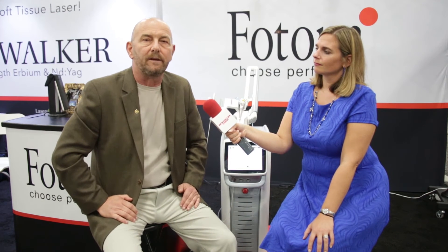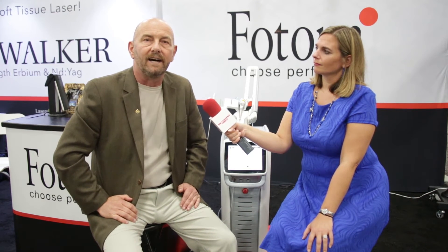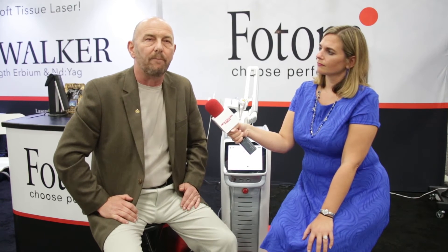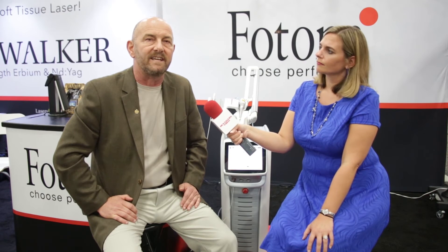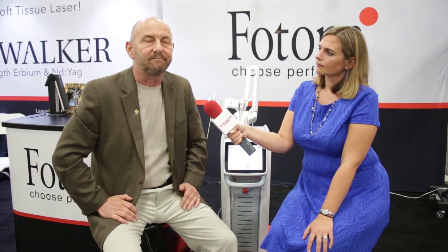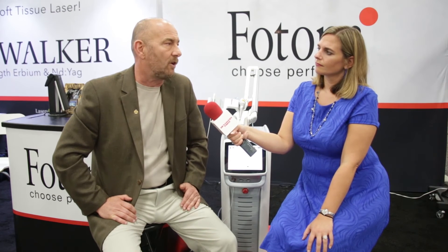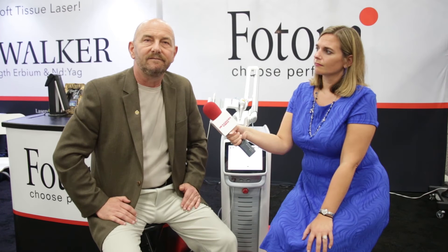That same type of technology can be used in periodontics, so when we're working with perio patients and cleaning out perio pockets and treating periodontal disease, we often use the Erbium laser and sometimes the ND YAG laser as well. We have multiple ways to utilize the technology in the office across many different procedures on a daily basis.